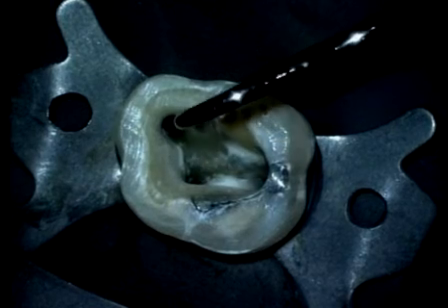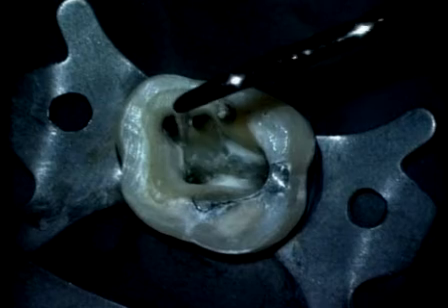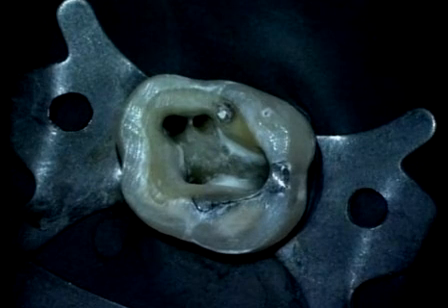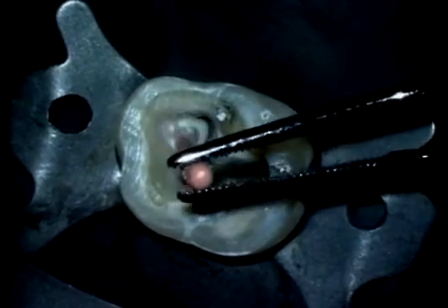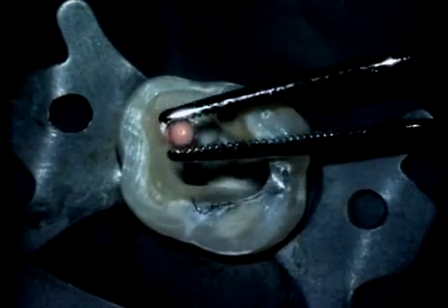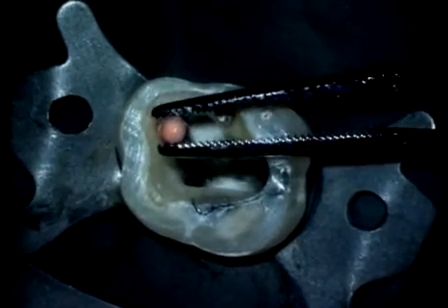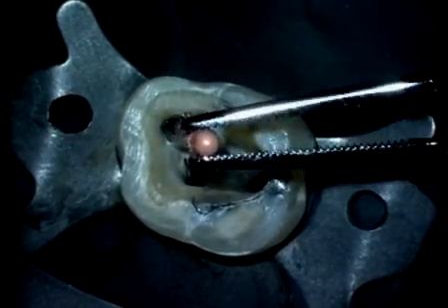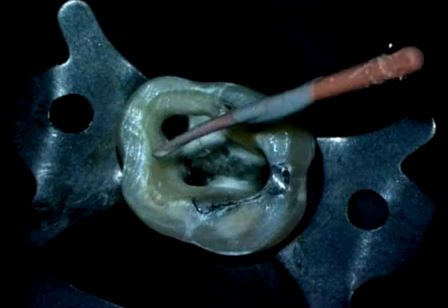The clinician needs to know with confidence that when resistance is encountered, the plugger is meeting thermosoftened gutta-percha and it's not binding on unyielding dentinal walls. The trimmed and radiographically confirmed master cone is buttered in sealer in its radicular extent. The master cone is gently teased into the canal. This allows sealer to be more effectively distributed over the length of the canal. The cone is removed and inspected to make sure it's either uniformly still buttered or there may be a denuded area.